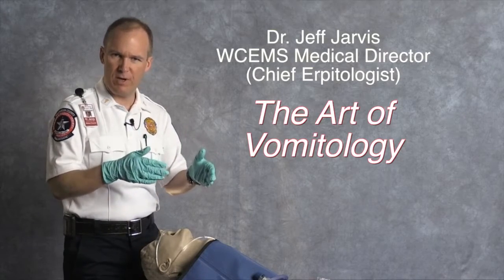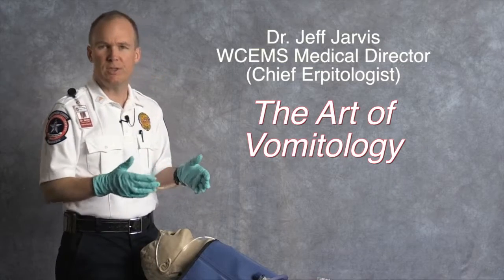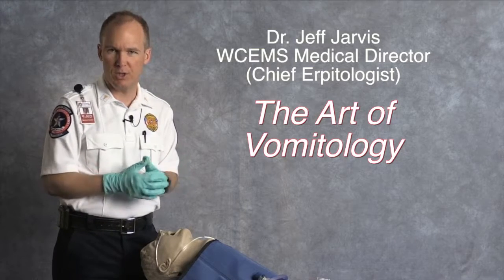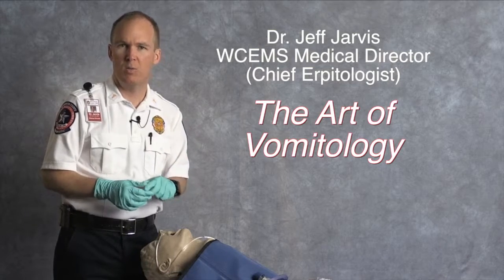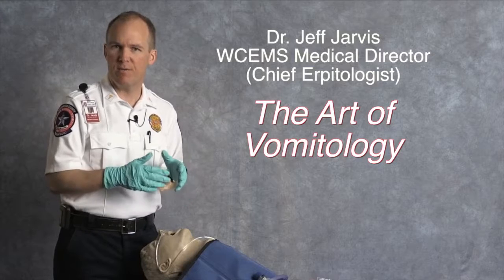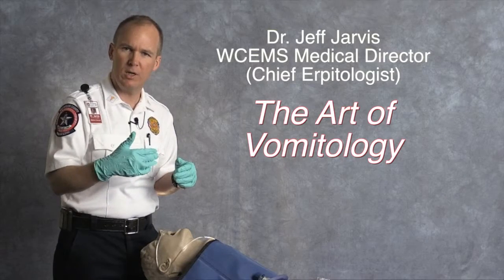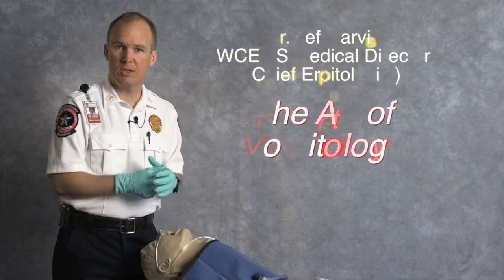We have another video out, actually several other videos out, that talk about tips and tricks for just using the King Vision. I want to focus on one of the limitations of any video laryngoscope, which is when you put the camera into a bunch of muck, whether it's pizza and beer or beans or blood or vomit, it's very difficult to see because the camera lens gets obscured by muck. So we want to try to avoid that, and I want to give some tips about how to do continuous suctioning throughout the intubation attempt.